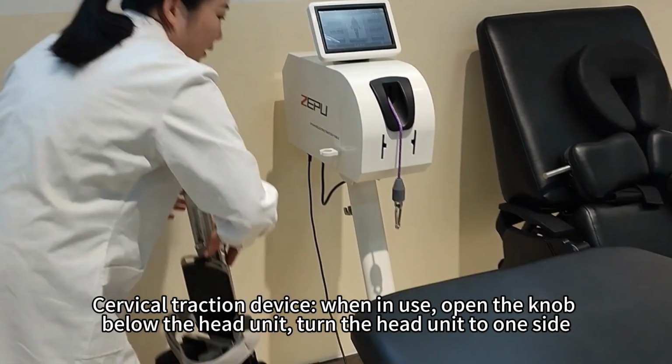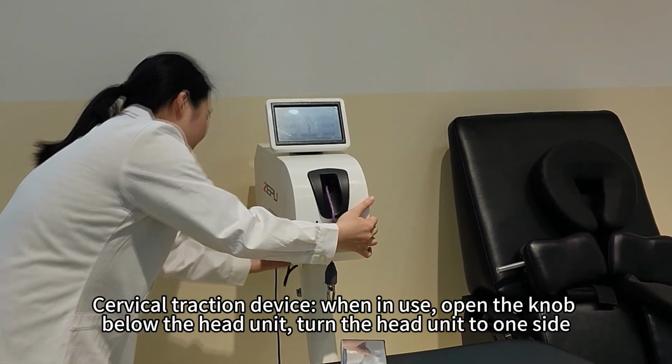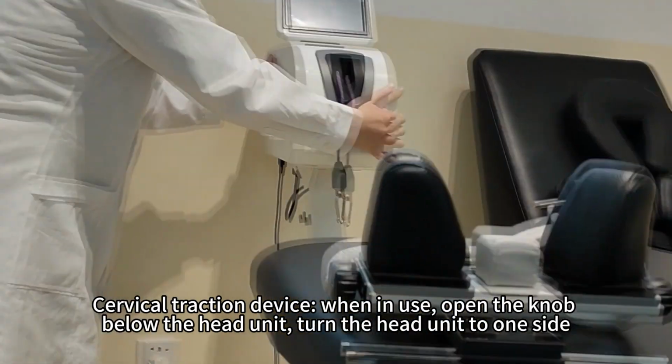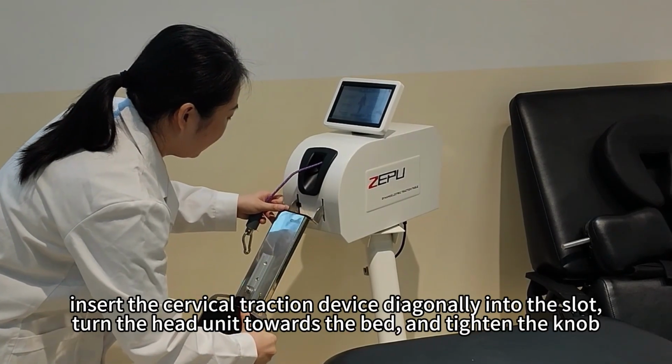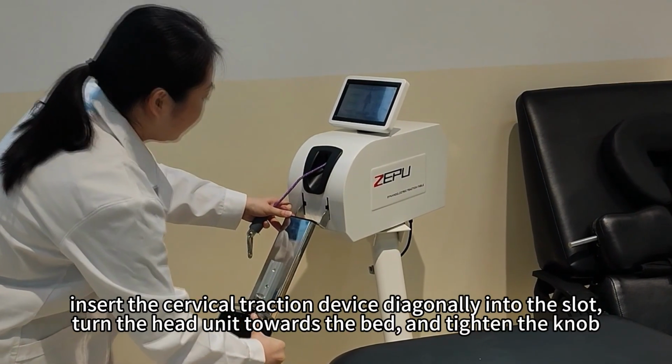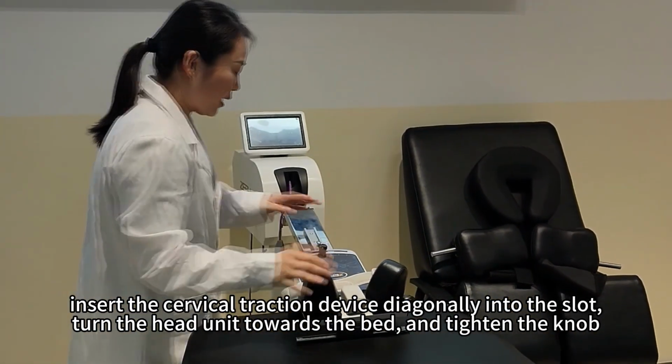Cervical traction device, when in use, open the knob below the head unit. Turn the head unit to one side. Insert the cervical traction device diagonally into the slot. Turn the head unit towards the bed and tighten the knob.